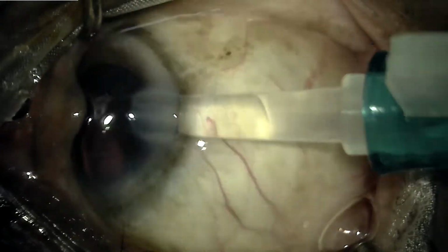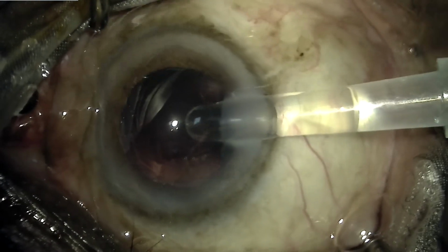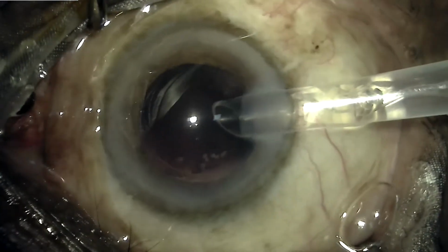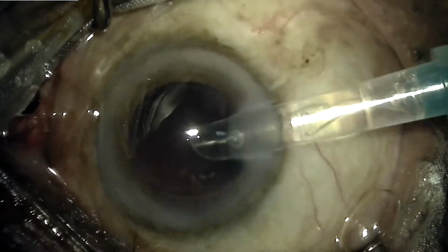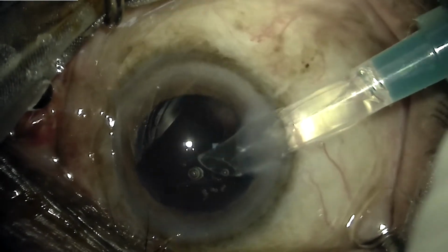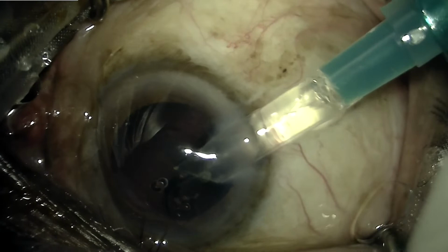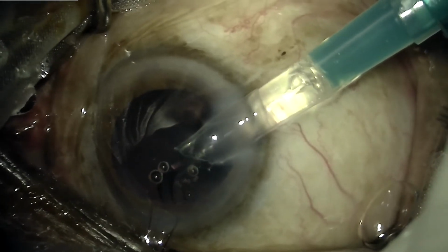Now, I prefer to implant an IOL in such a situation in the sulcus, and for this I find that even single piece IOLs do the job justifiably, and I have not seen any complication in my cases. Although it is also recommended that 3-piece or multi-piece IOLs are a better choice for implanting into the sulcus. But when we look at other alternatives like phakic IOLs being implanted in the sulcus, I don't find there's any reason to shy away from these IOLs being implanted in the sulcus.